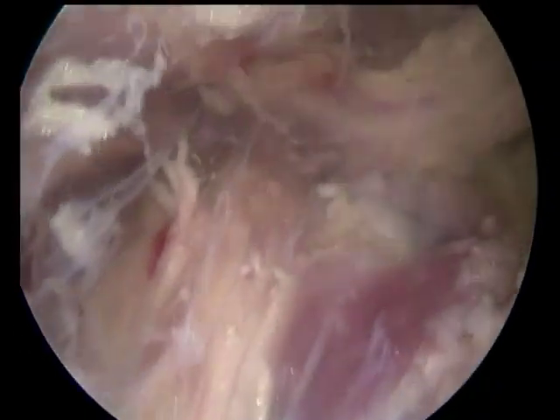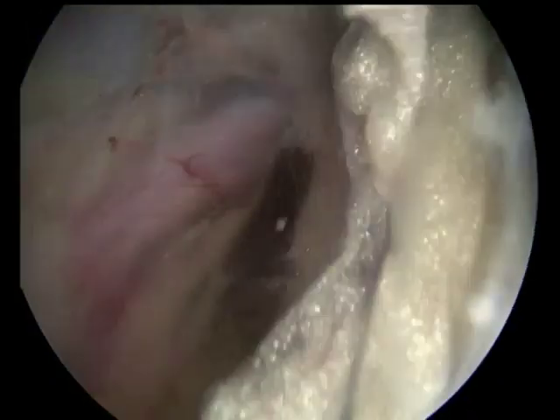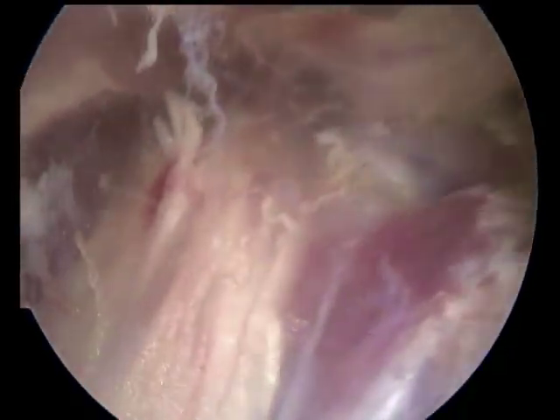And this is the final view of sciatic nerve after decompression. This is the infrapiriformal space. We see it proximally. And this is inferior gluteal artery, which is located medial from the sciatic nerve. And this is the final view.